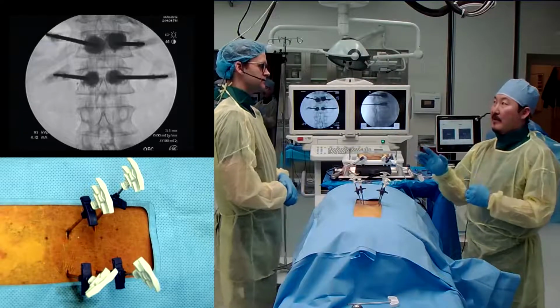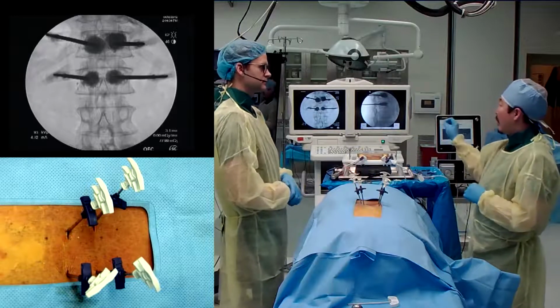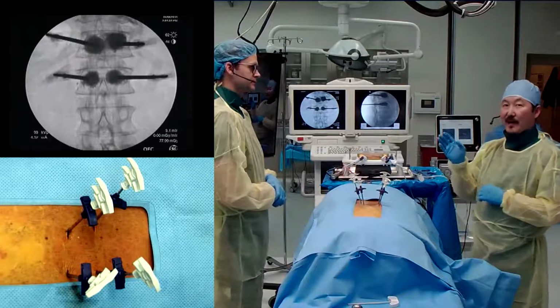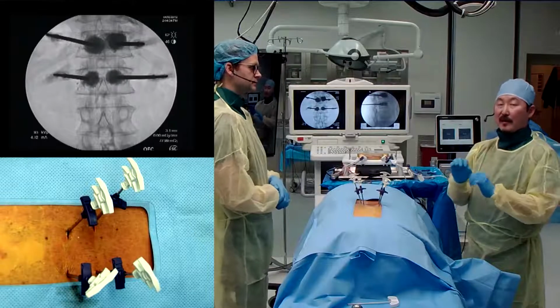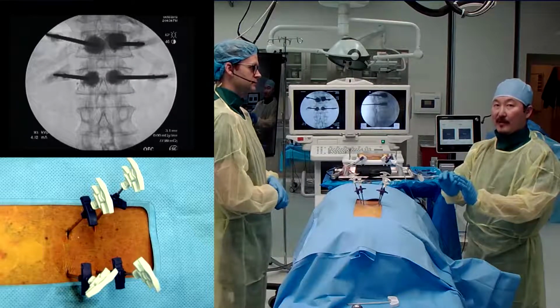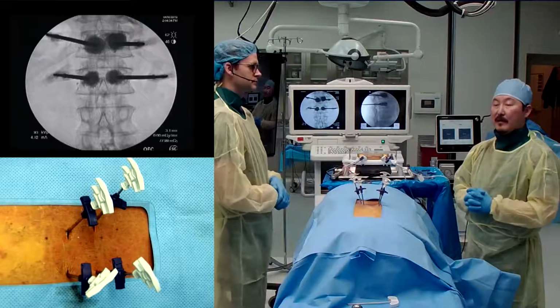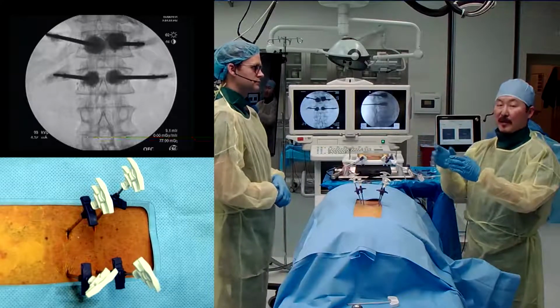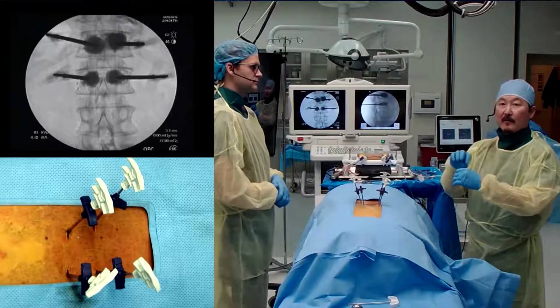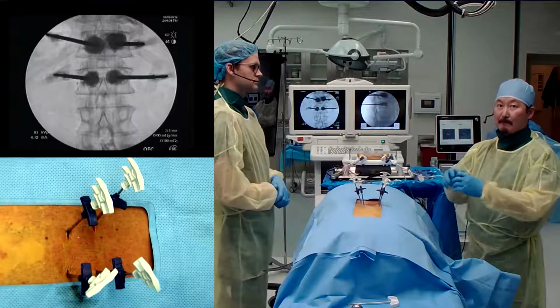But again, in a real case, if I even saw a little flash of dye going into that posterior plexus, I would stop right there, advance it more anteriorly, and continue, being very cautious about filling very deliberately.